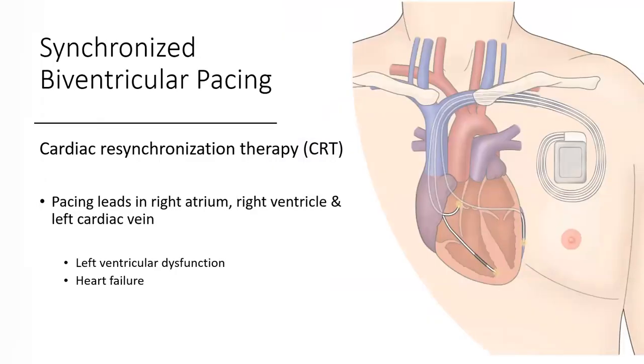Synchronized biventricular pacing, so cardiac resynchronization therapy. Pacing leads are in the right atrium, right ventricle, and left cardiac vein. Left ventricular dysfunction and heart failure are both reasons we might use this.